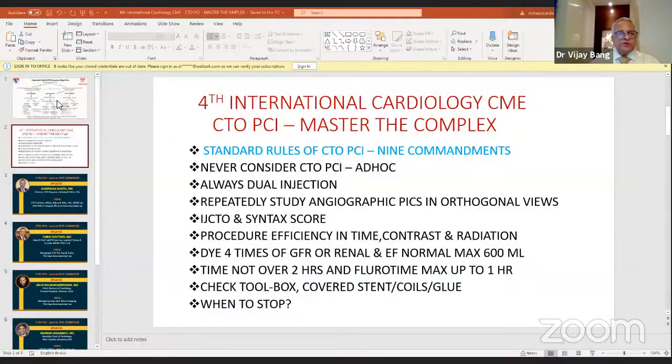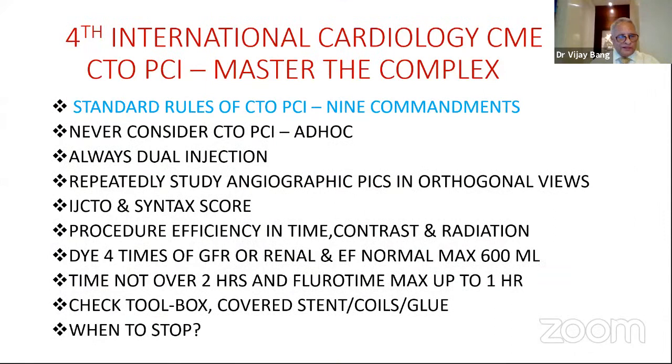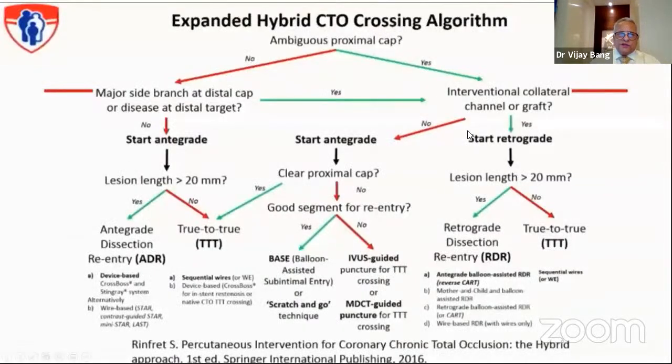CTO is one procedure where we have to be very careful in assessing the angio properly. Because the procedure is expensive and the complication rates are higher, we need to repeatedly study the angio to decide the strategy.